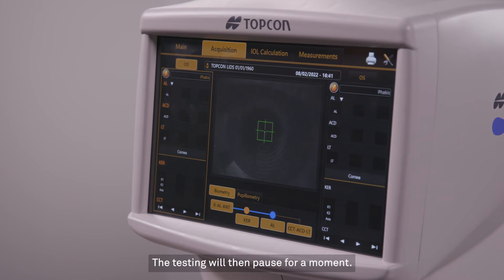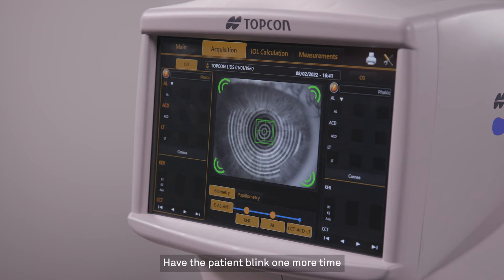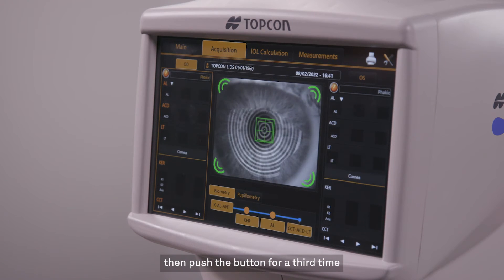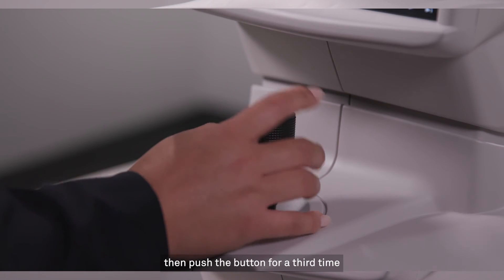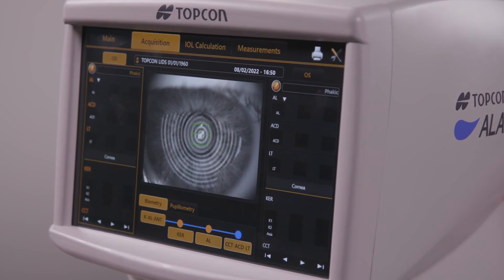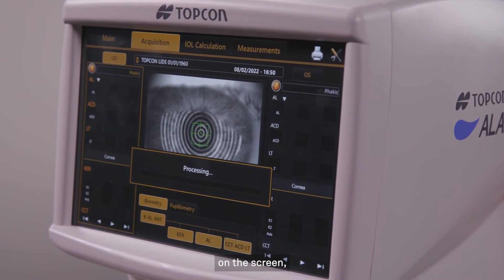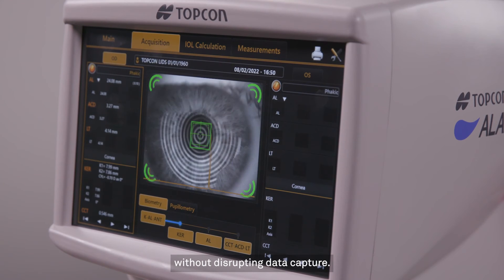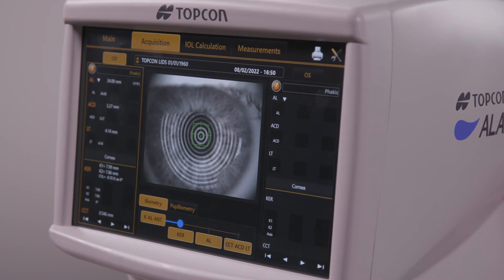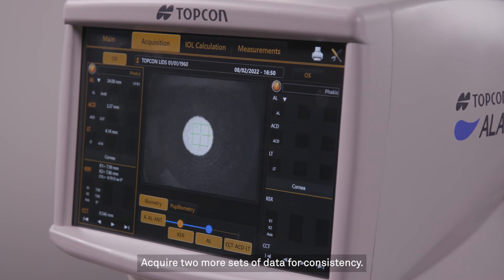Push the button again and the Aladdin will acquire keratometry and axial length measurements. The testing will then pause for a moment. Have the patient blink one more time to replenish the tear film, then push the button for a third time to acquire the anterior measurements. When the word 'processing' appears on the screen, the patient can blink again without disrupting data capture. Acquire two more sets of data for consistency.